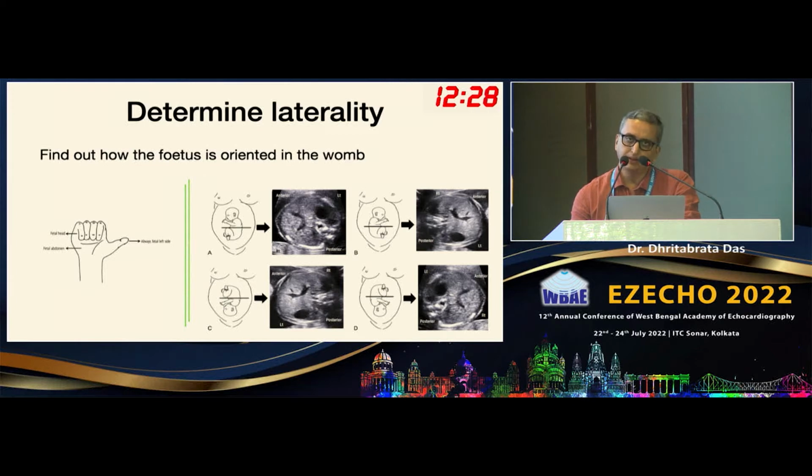There are different methods. You can use whatever is suitable and easier to you. What I personally use is to imagine myself in the fetal position. If you take the C, where the fetal head is down, so it is a cephalic presentation with the legs up and the spine is to the mother's left, then the left side is down.